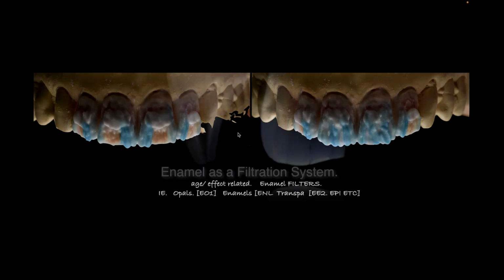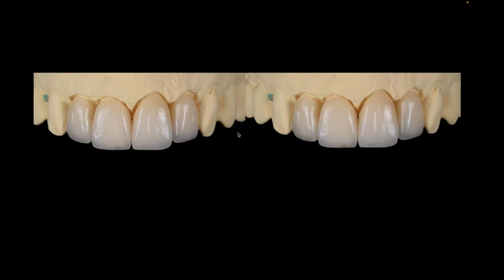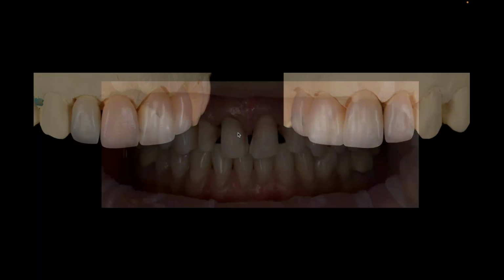So I'll finalize all my dentins. I'll come back and I'll use some enamel materials. And now I'm using my enamels as filtrations to mask out what I've done in my dentin window, or I'm using my window to cover my dentins, which is probably a better way to say that. I'll finalize that so I have the best light transfer, and then I have my finished veneers, and I'll send those back to my clinical partner, and they'll be able to start placing them.